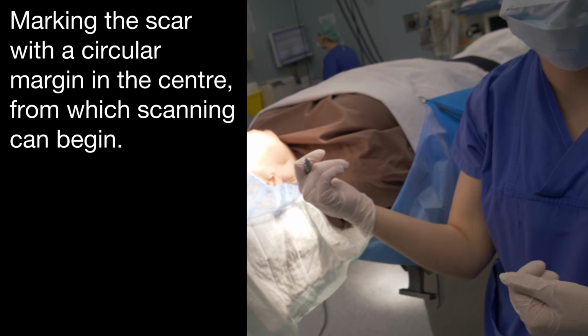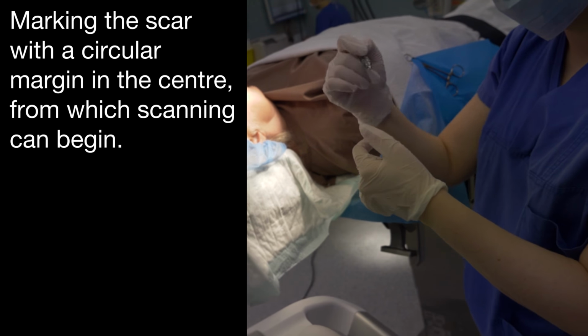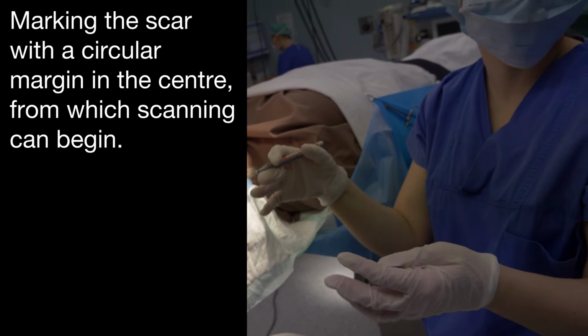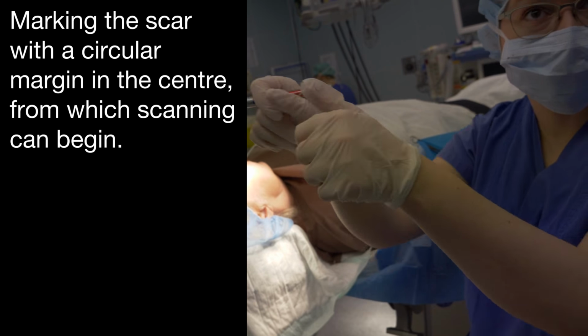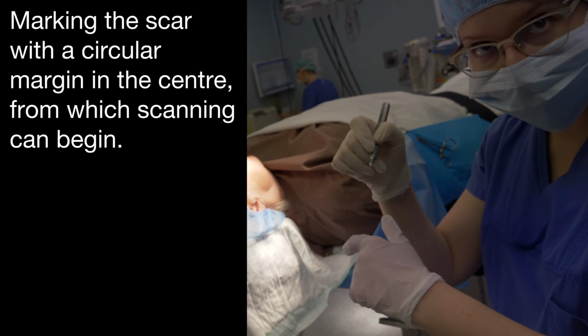They did a primary closure. Okay. So you have this boat shape. Oh yeah. And then normally in the upper and in the lower part there is no tumor. So it's just for closure. Okay. So the tumor is just in the center. This is why I will mark it just in the center. Okay.